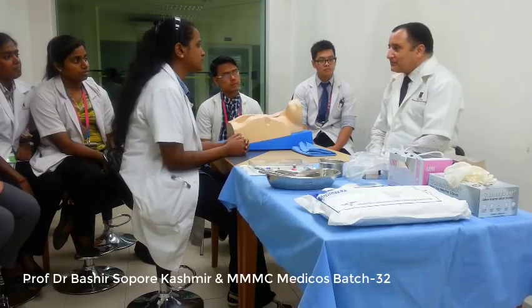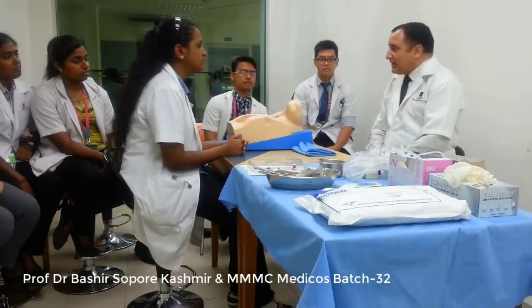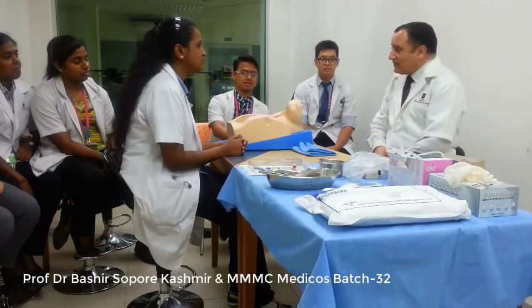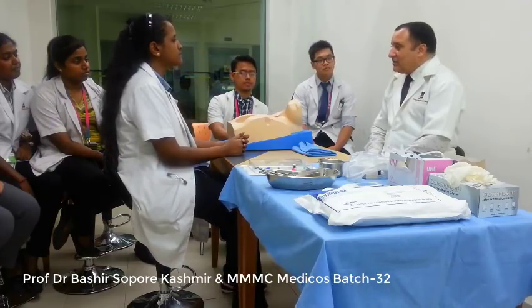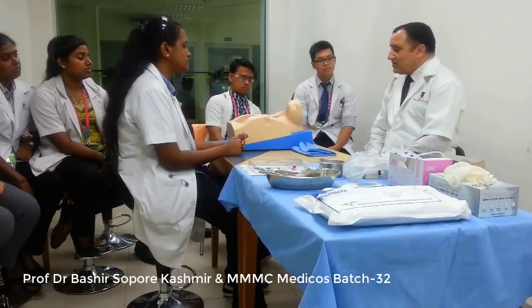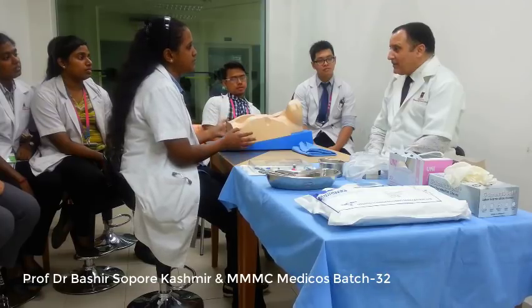And once the patient is put in this position, then the internal jugular vein will become distended, and it will be easy for you to localize this vein and to insert the needle in the internal jugular vein. Now we have a specimen here.